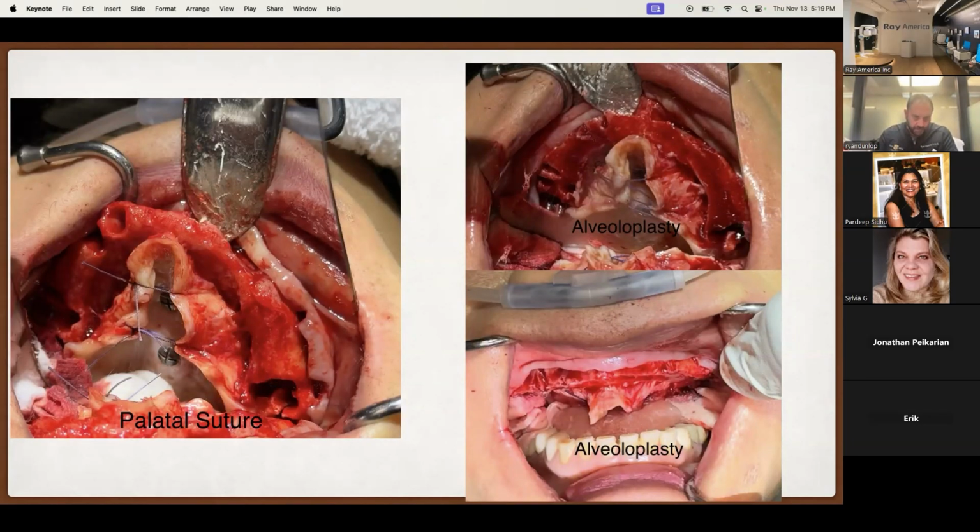I like to use ceramic burrs because they don't overheat and they cut a very, very flat table like this. Some people will use saws. Some people will use rongeur, bone file. There's a lot of different ways to remove bone. At our courses, we teach a handpiece-driven ceramic acrylic burr to really mow down that bone in a quick, efficient, clean way, but also to have it be very, very flat for our implants.